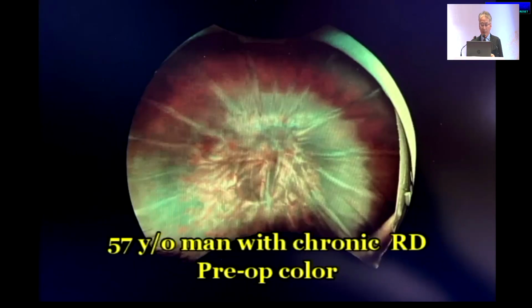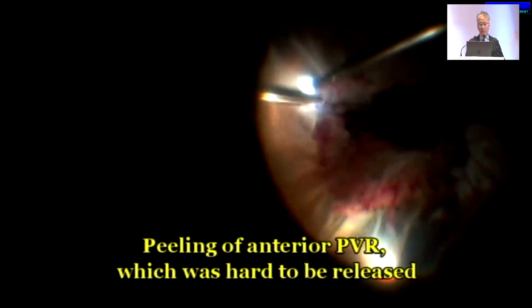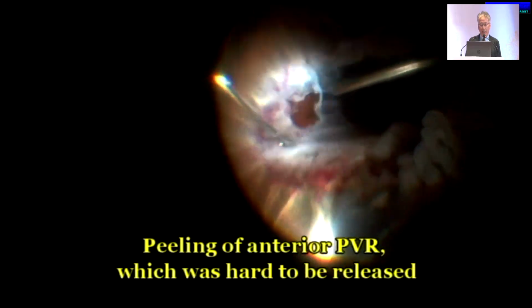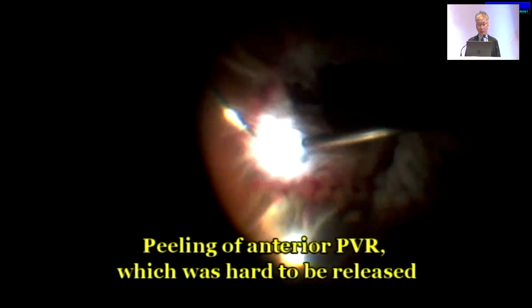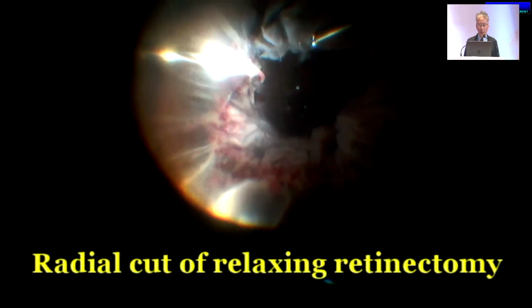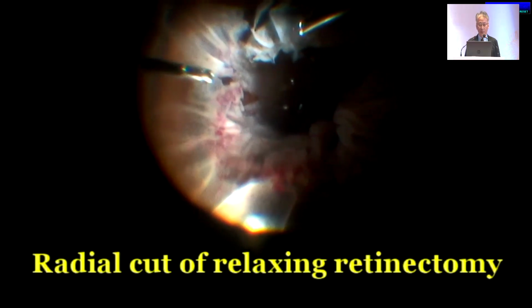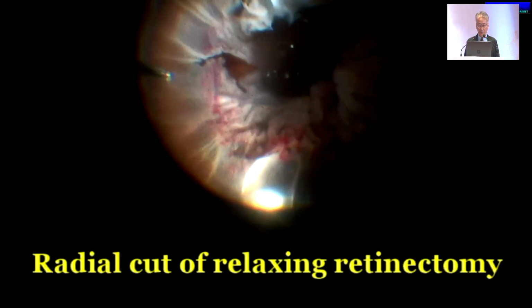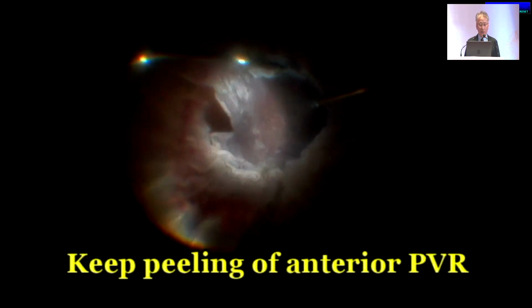I want to show another case. This is a patient with a chronic retinal detachment. This is the pre-op picture. You can see there was previously a big hole there. I tried to peel the anterior PVR, which was hard to release. Then I followed this with a relaxing retinotomy, and I also did some radial cuts to try to flatten down this relaxing retinotomy. This is the giant tear I created after the retinectomy.